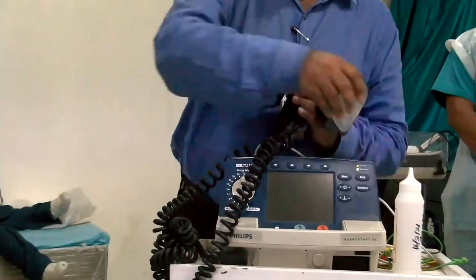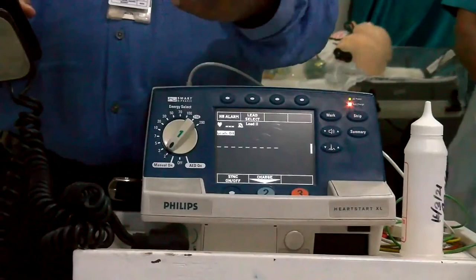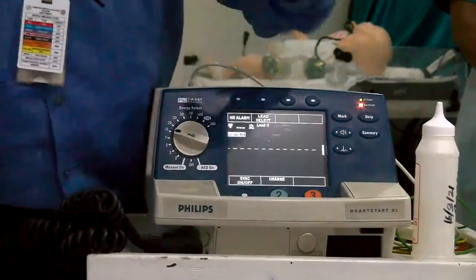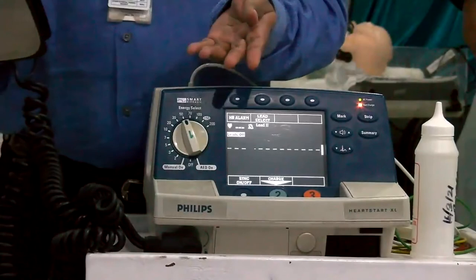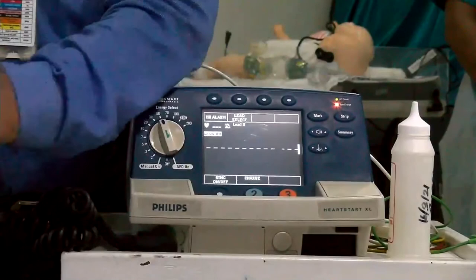The charge can be selected here. As I told you, 2 joules per kilo; if the child is 20 kilo, 40 joules. If 40 is not available, you may go to the higher joules, 50. Joules are selected here. The next step is charging.